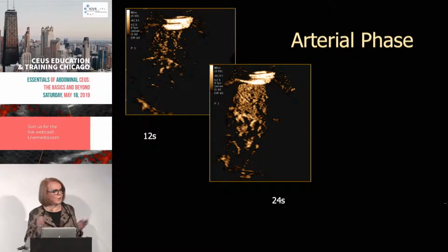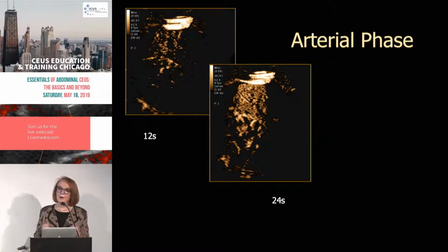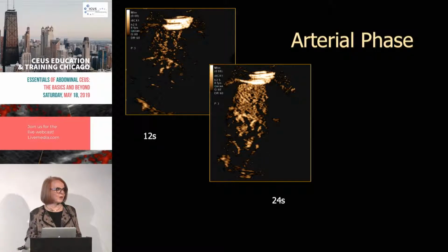Then as we got more into clinical things, and still at the Toronto General, they book the physician to do contrast enhanced ultrasound. They have a physician there, that's what they're there for. They have someone to start the IVs, and so they do all the scans. Now, when I went to Calgary, that's what I thought I would do as well. Recruit a nice radiologist to work with me, and that we would do scans like that. It was not very long after I was there that I realized there was not much chance of that happening.